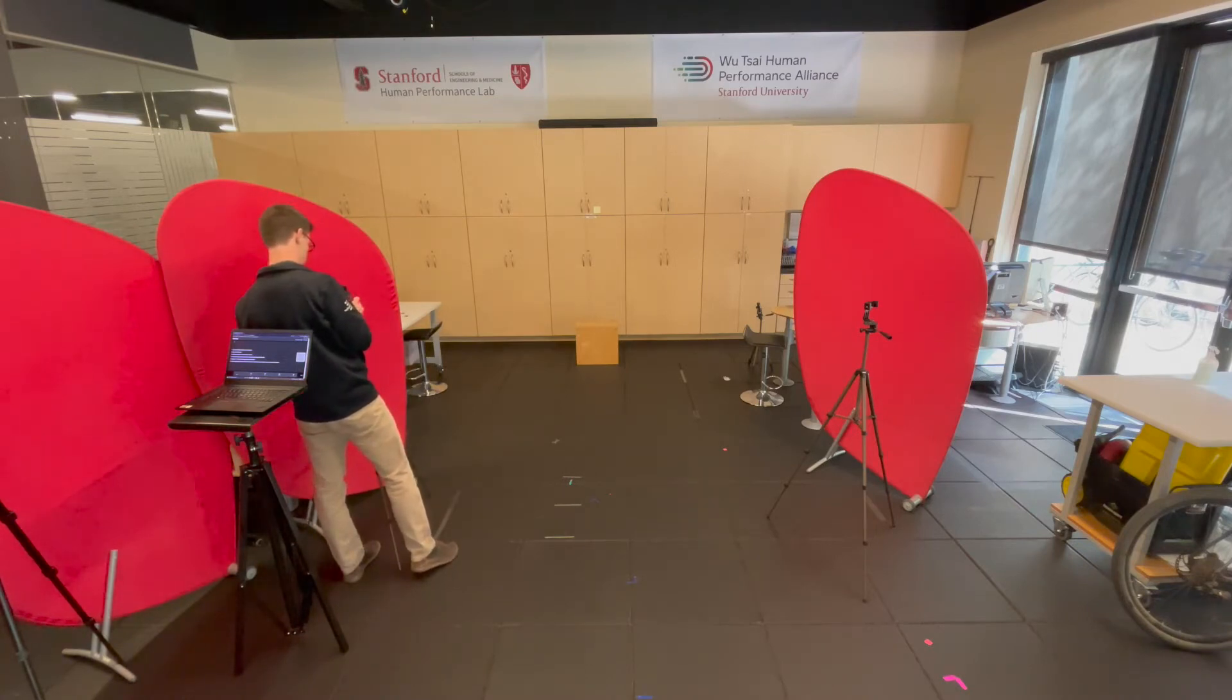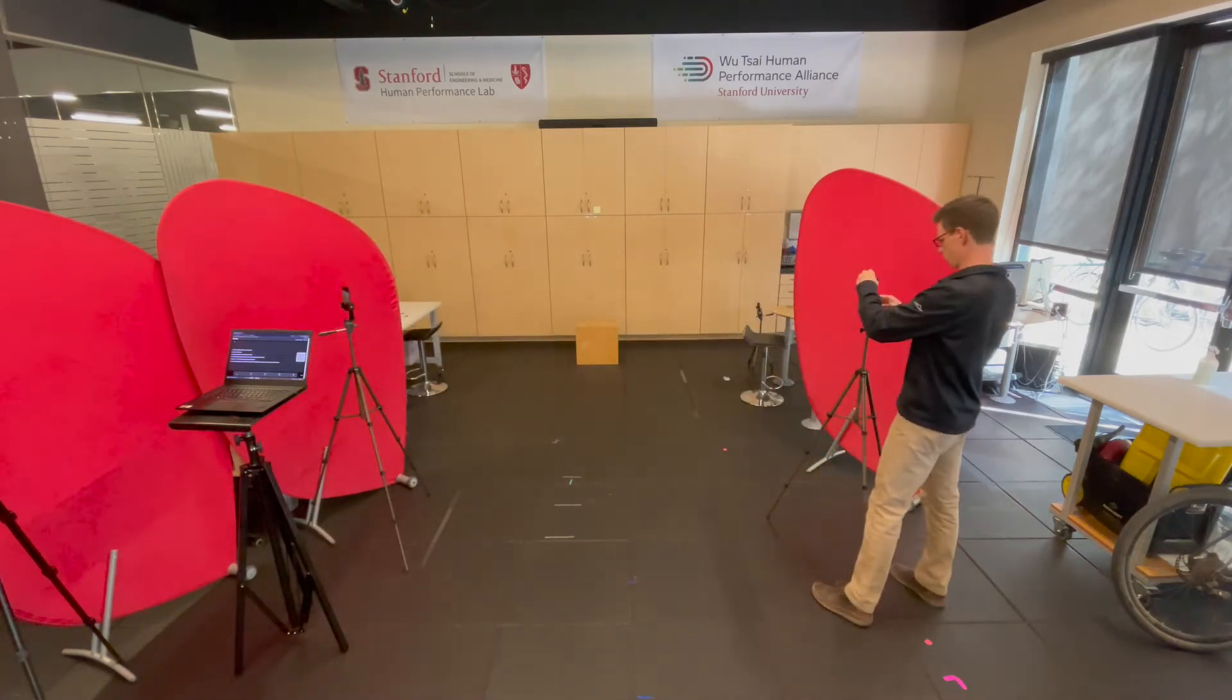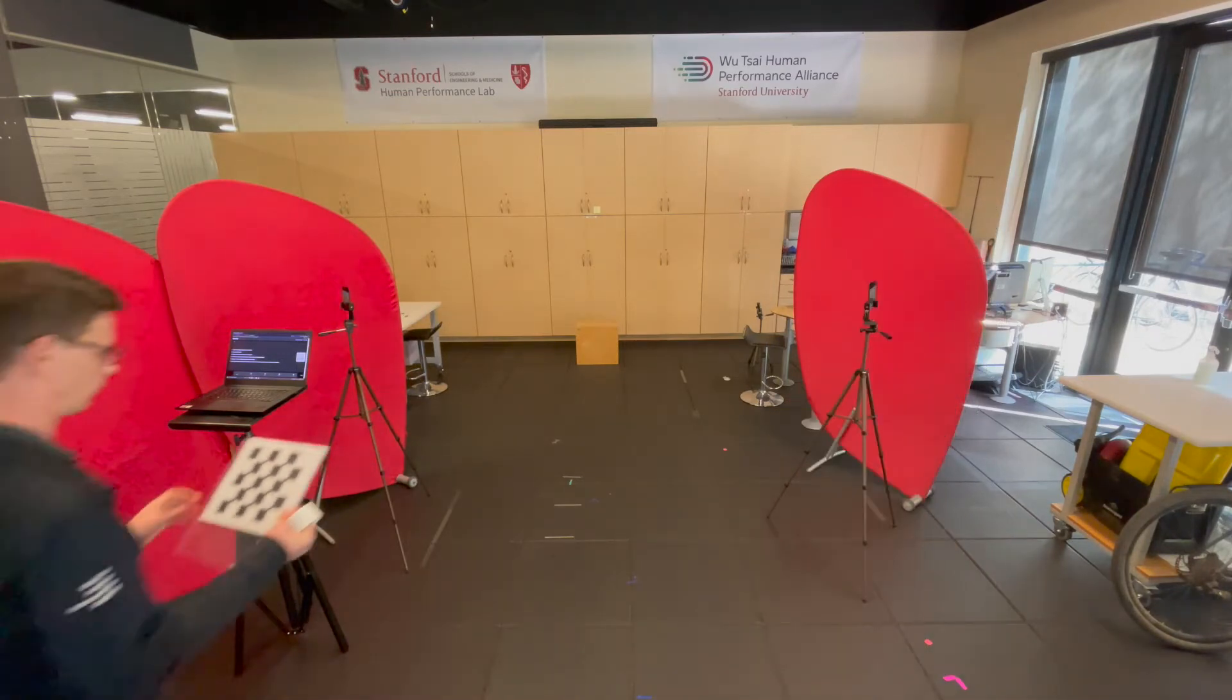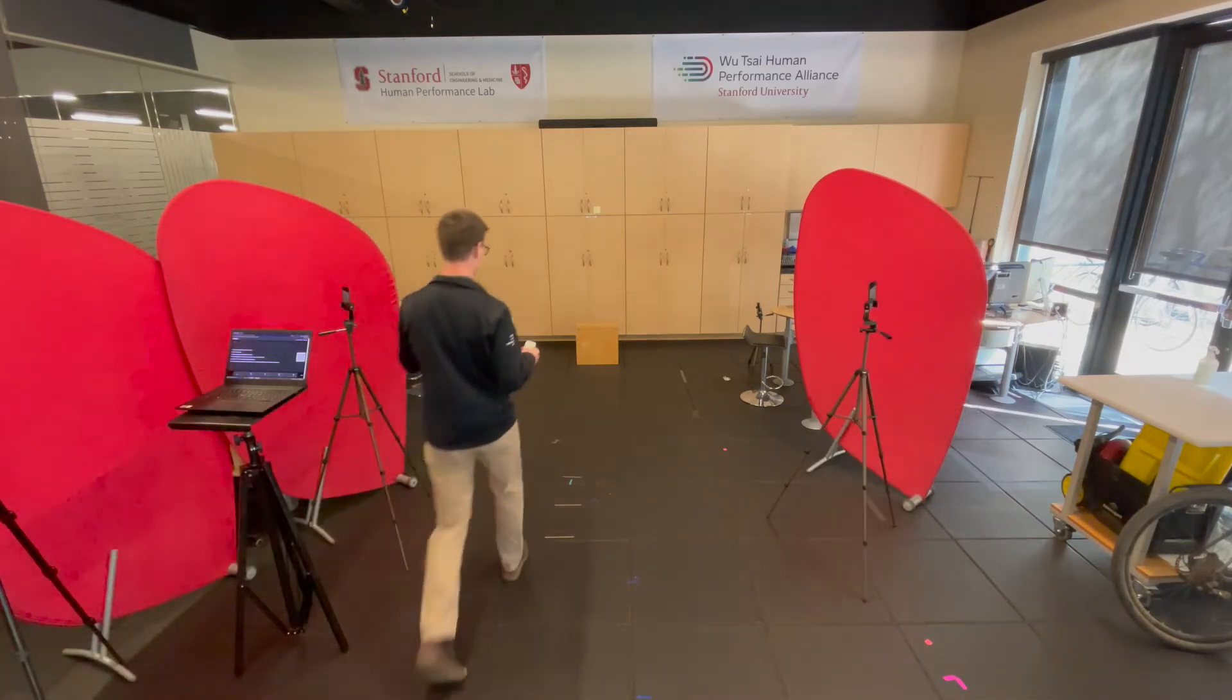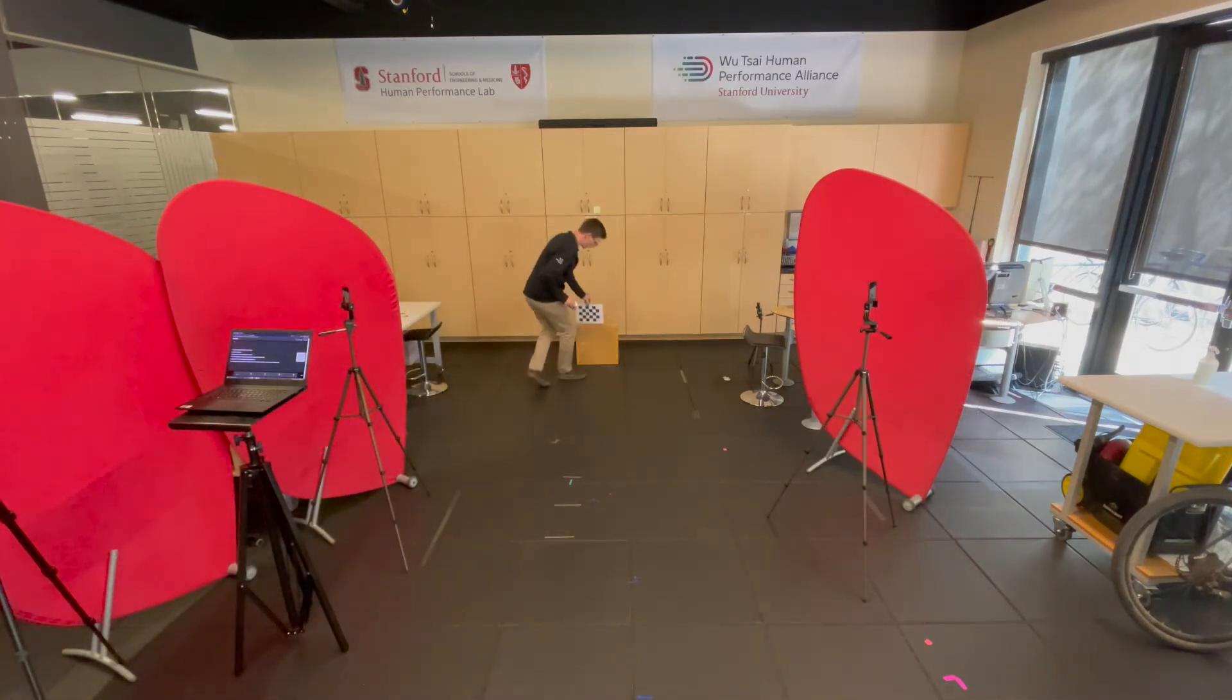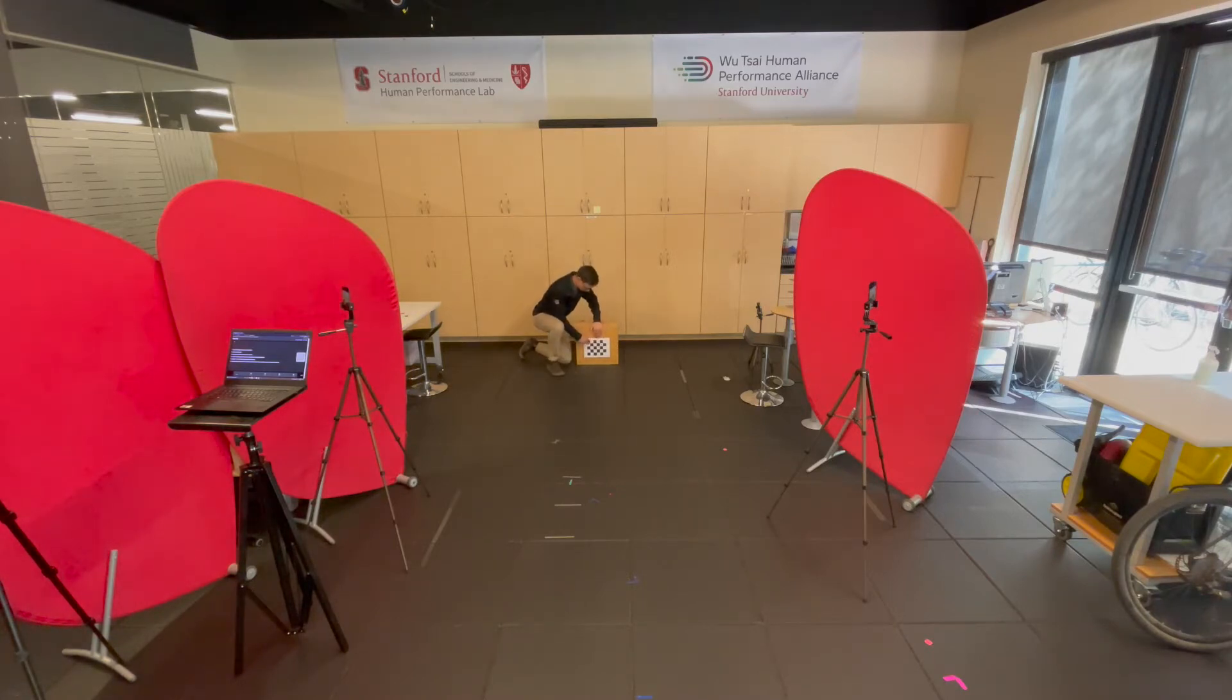Then mount these devices firmly on the tripods. Bring the calibration checkerboard into the field of view of all cameras and you want this checkerboard to be as close to the cameras as possible while still in each camera's field of view.